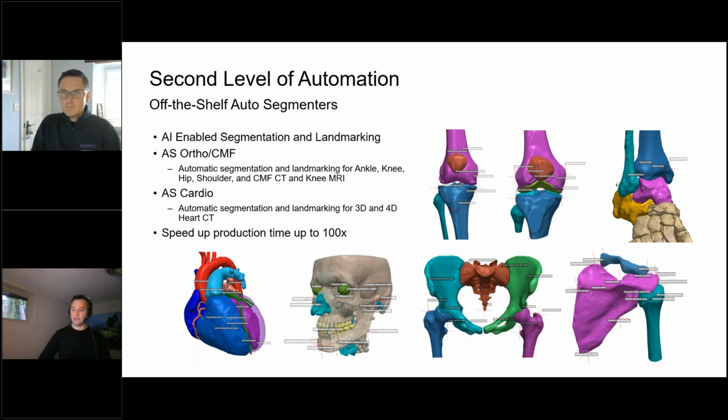And we were able to speed that up, write some scripts, and have stuff that's going to be in the software soon, where we can bring that down to a day to do 20 cycles of segmenting the heart and the blood vessels. So we posted that on LinkedIn. If ever anybody missed that or is interested in it, please reach out. I'd be happy to share it with you.